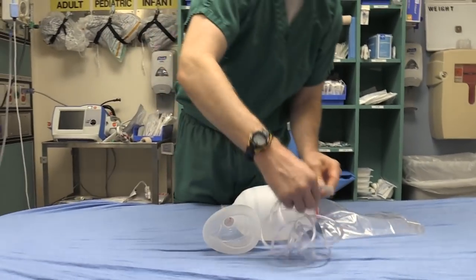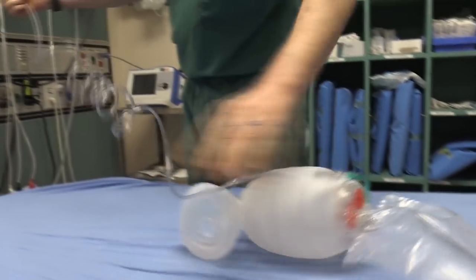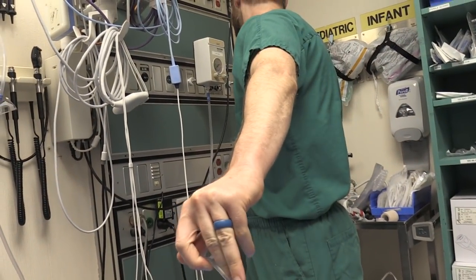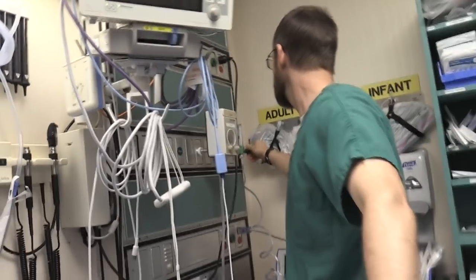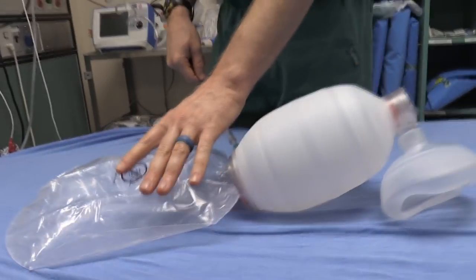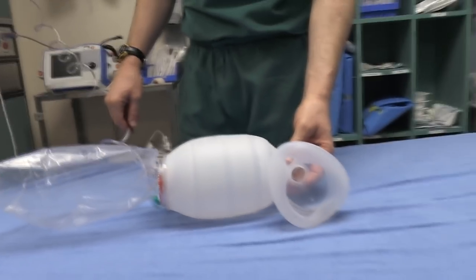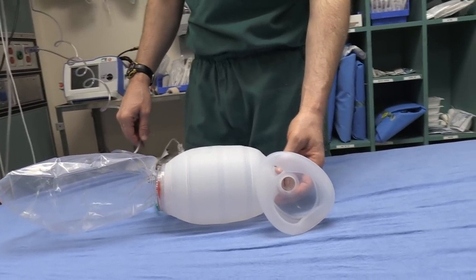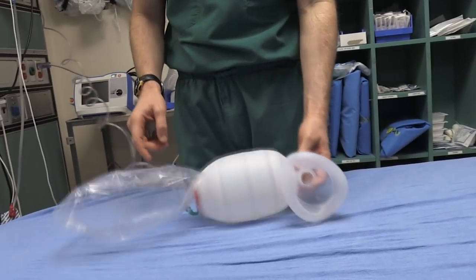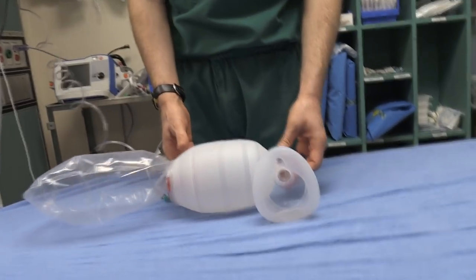So these are the same. Put this into here. Crank this up to 15. All right, so the reservoir bag's starting to open up. Now I want one of us to try it, because sometimes you can pre-oxygenate with a bag valve mask, and the pre-oxygenation is actually sometimes excellent. I want to just see how it feels if you can breathe through it.